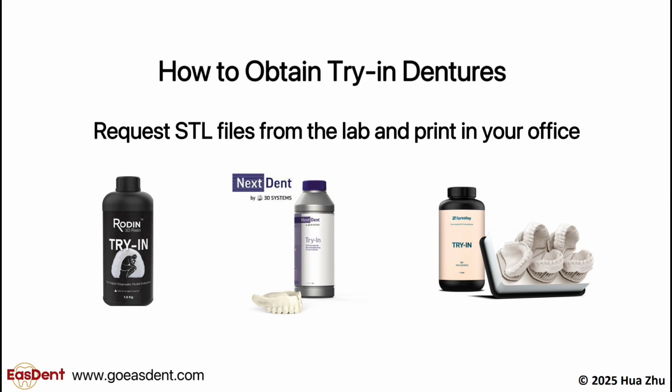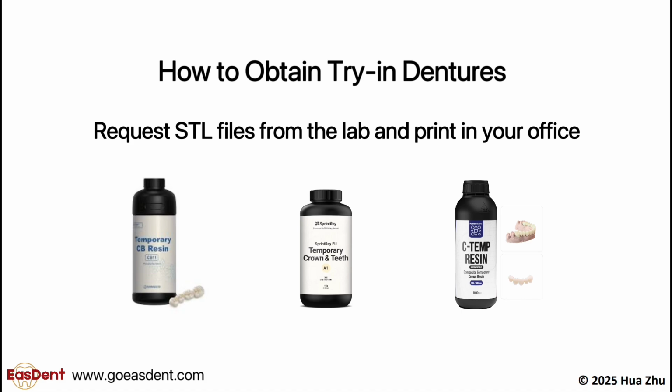You can also use the 3D printing resin for temporary crowns and bridges, which are classified as FDA Class 2 material, to print try-in dentures. They can be given to the patient to take home as trial dentures. The patient can have extra time to evaluate the comfort and aesthetics. This resin usually comes in multiple shades that closely match natural tooth color. However, they're more expensive and you will not have pink color for the denture base area.